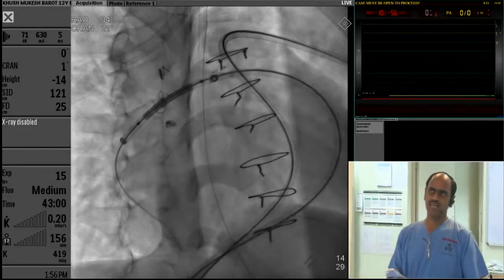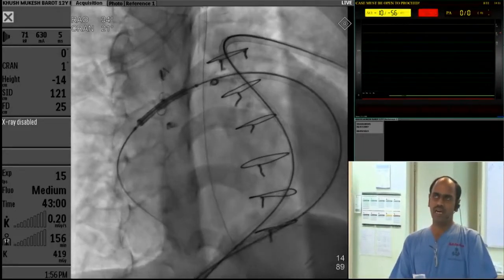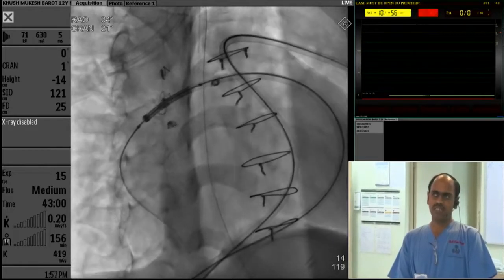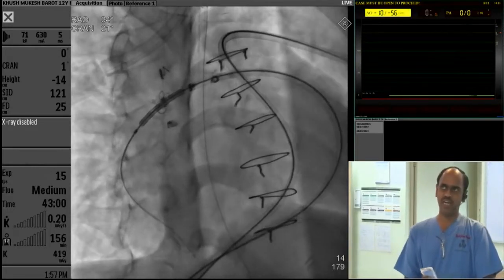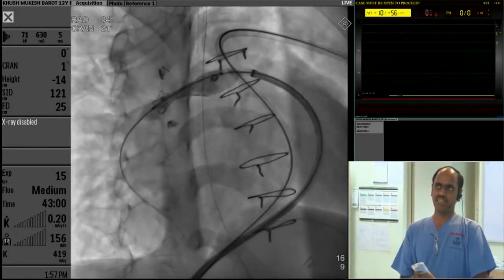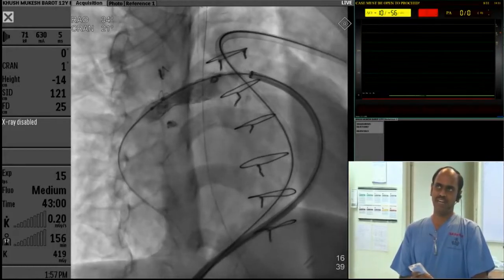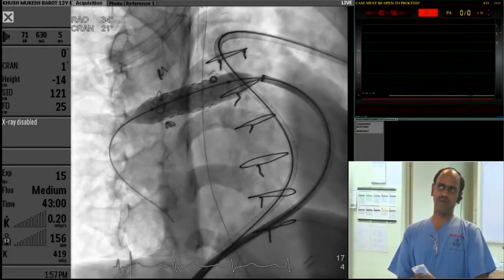So we had two sheaths. We decided to put in a 12 mm stent using the Zephyr stent — an Indian-made stent presented by Dr. Avinash today — in the right pulmonary artery. We checked the positions, inflated, and got the gradients in the right pulmonary artery down to 10.